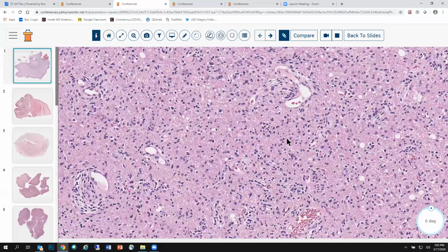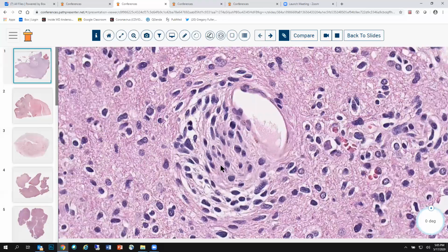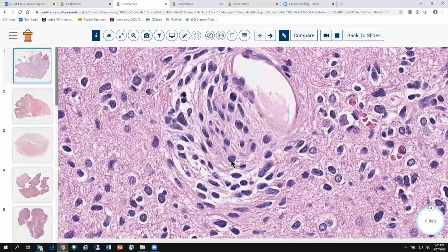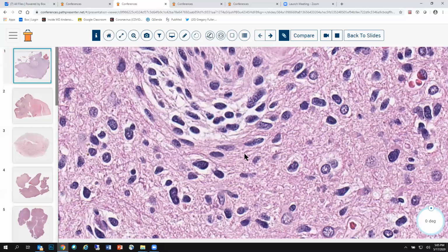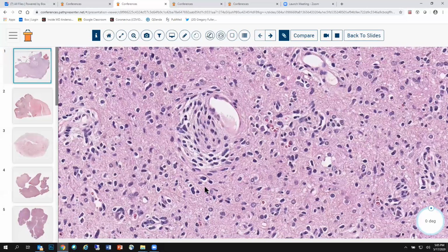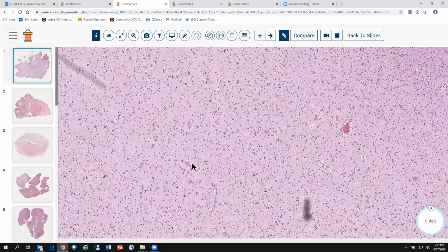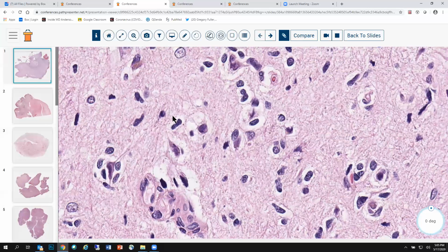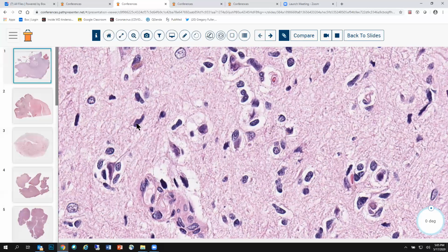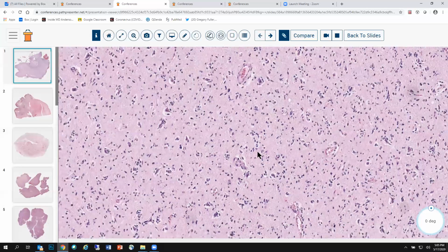In the old days, we might have called a tumor like that mixed oligoastrocytoma, but we know that the majority of those, probably 75–80%, are molecular astrocytomas. So you're going to be looking very closely for these elongated nuclei, pleomorphic nuclei. Let's follow the tumor as it infiltrates the overlying cortical ribbon. And again, as we go to higher power, we can see that many of the cells have this elongated shape. That's an infiltrative morphology of astrocytoma. So all of the cells you're seeing here really say diffuse astrocytoma.